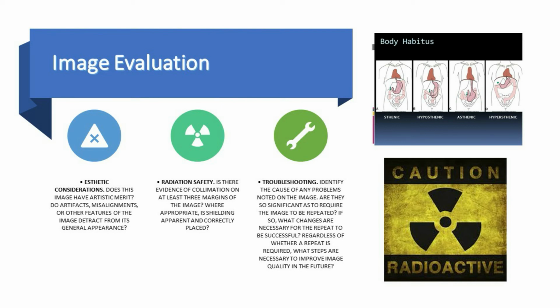Identify the cause of the problem noted on the image. Are they so significant as to require the image to be repeated? If so, what changes are necessary for the repeated image to be successful?